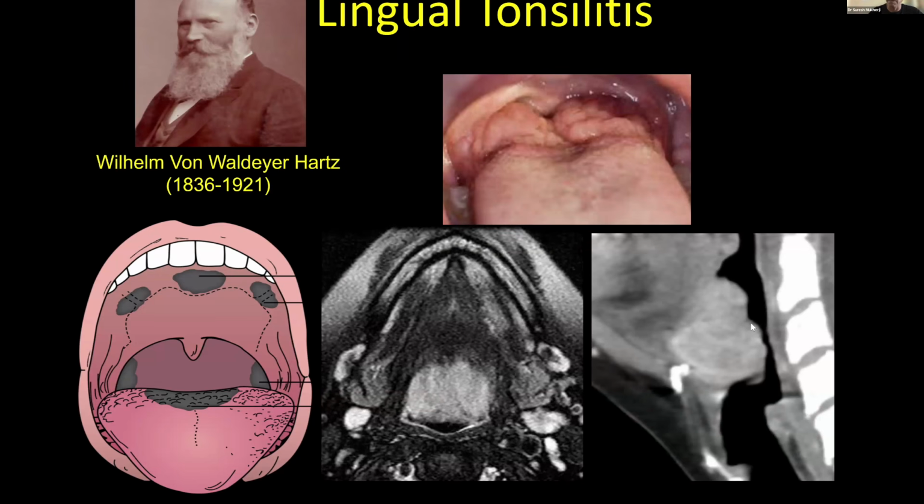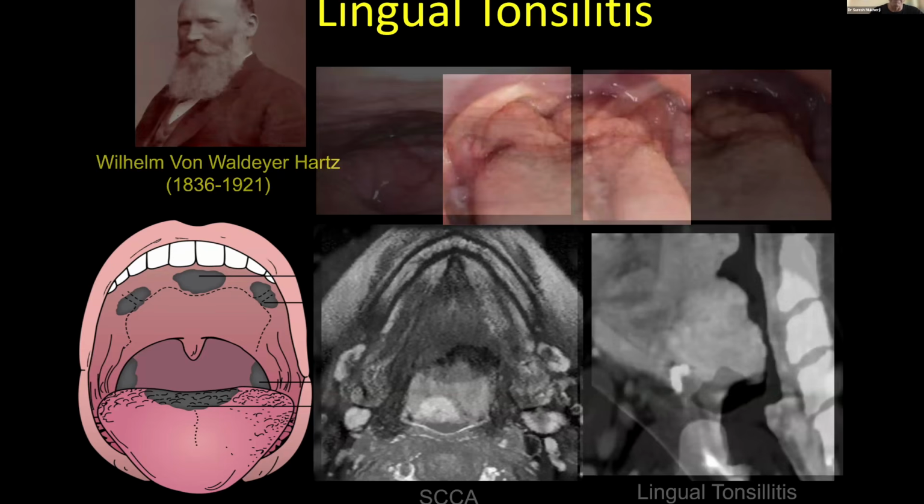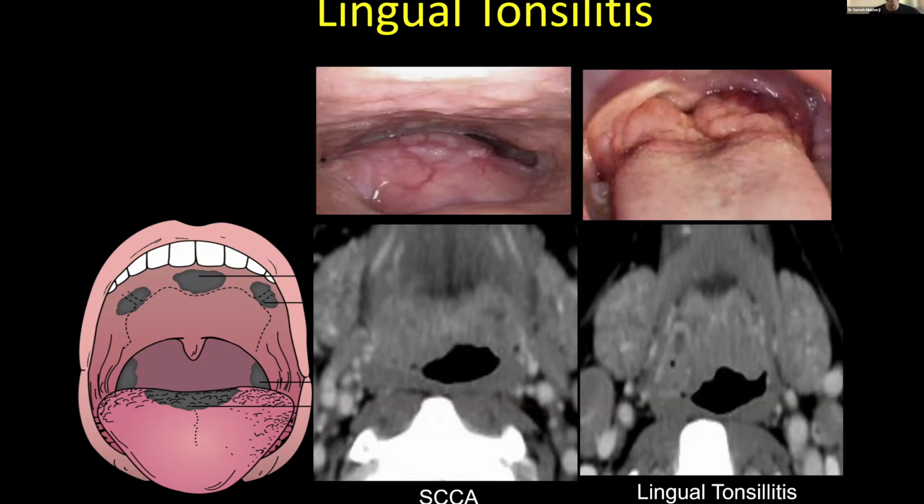So if I'm not sure about this, I'll go ahead and mention there's increased soft tissue in the region of the lingual tonsils, and this area can be evaluated with direct visualization and palpation, similarly to like you're looking at someone's mouth. So when you do get into this conundrum, just realize, fortunately, this is a very easy area to see.